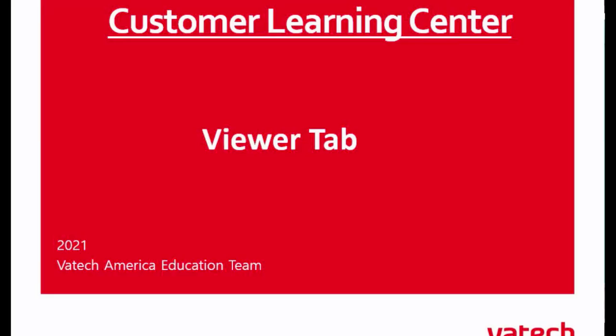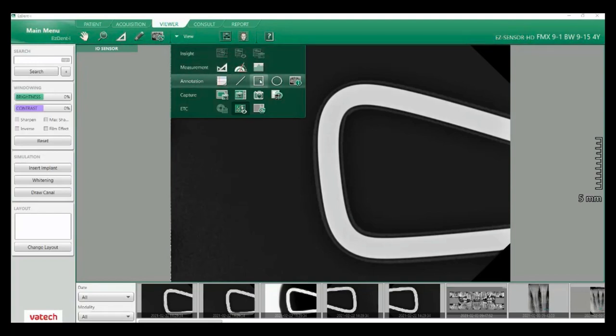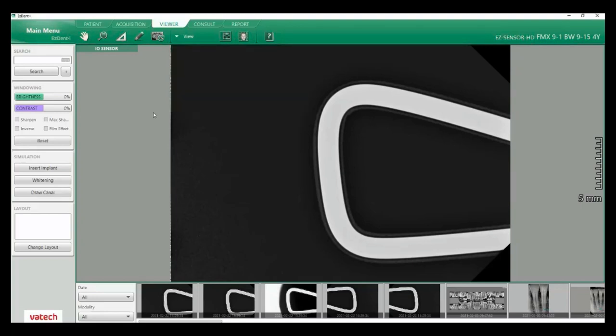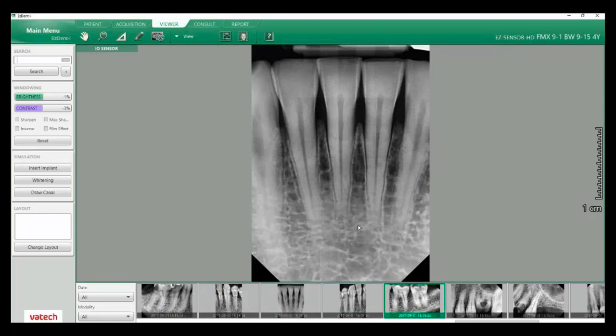Next let's look at our viewer tab. We've just gone to the acquisition tab, taken all of our images, and we're going to go over to our viewer tab to view those images. We still have all of our tabs at the top. In this case we have certain icons that will help us manipulate the image: the panning tool, magnifying, measurement, drawing, and our reset image, along with a drop-down with measurement sub-tools, annotation tools, capturing, and more. Off to the left we have our windowing, brightness and contrast, some filters, implant planning, drawing our canal, and our change layout. This is the default window — you see one large image at the top and at the bottom you can scroll across to see your individual images. I can also left-click and drag images into my main window.